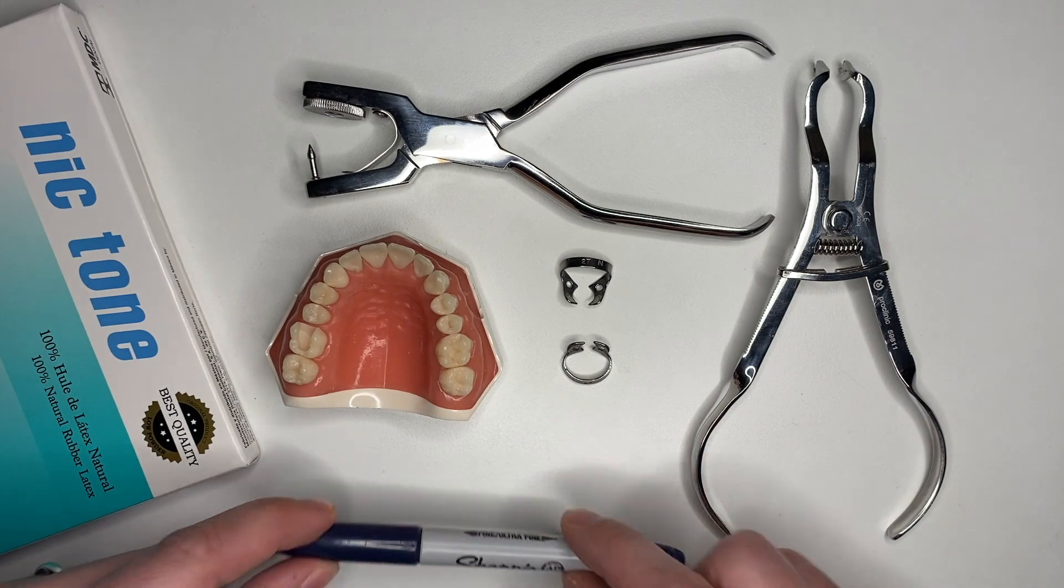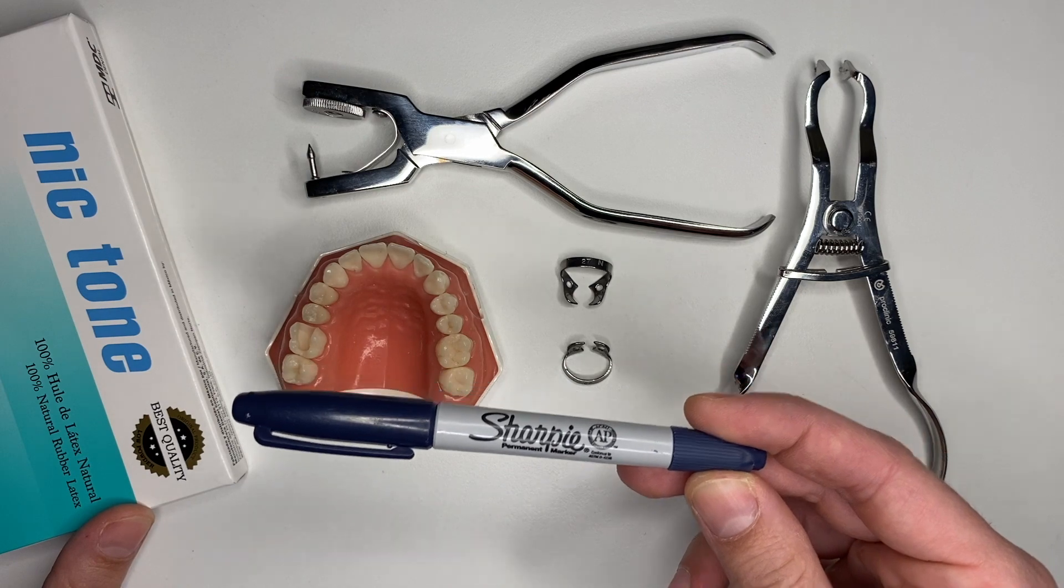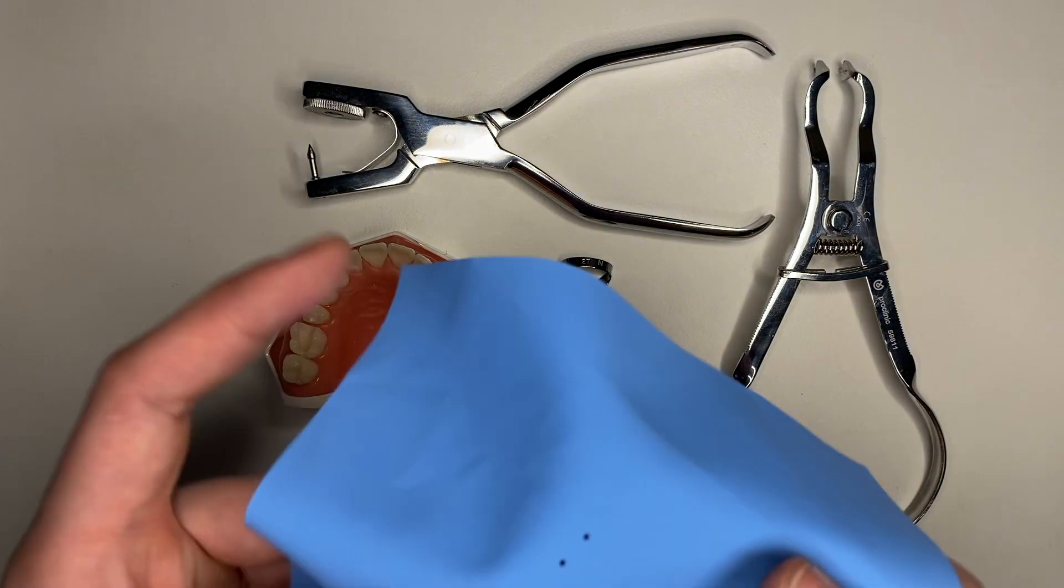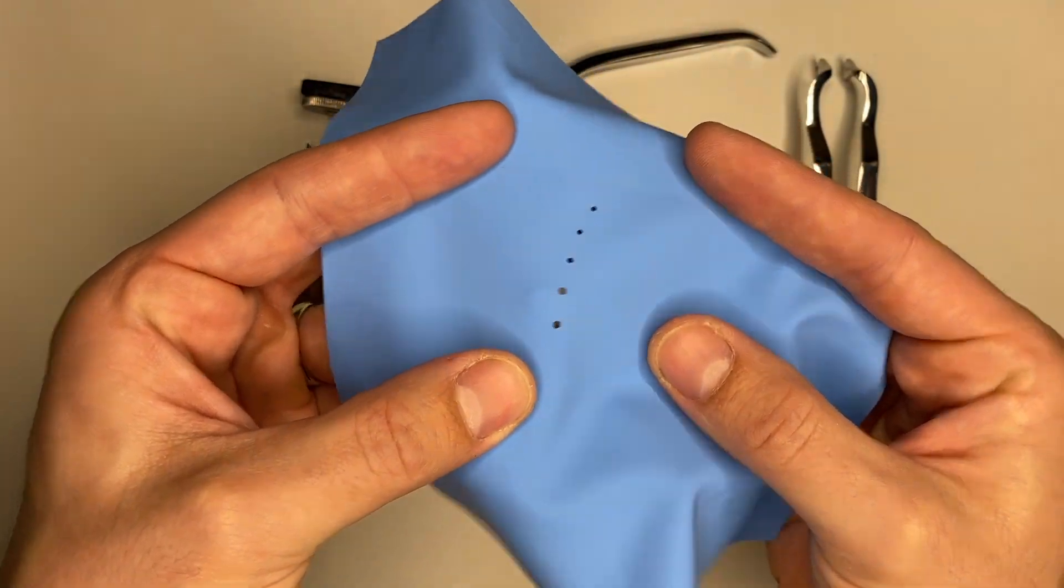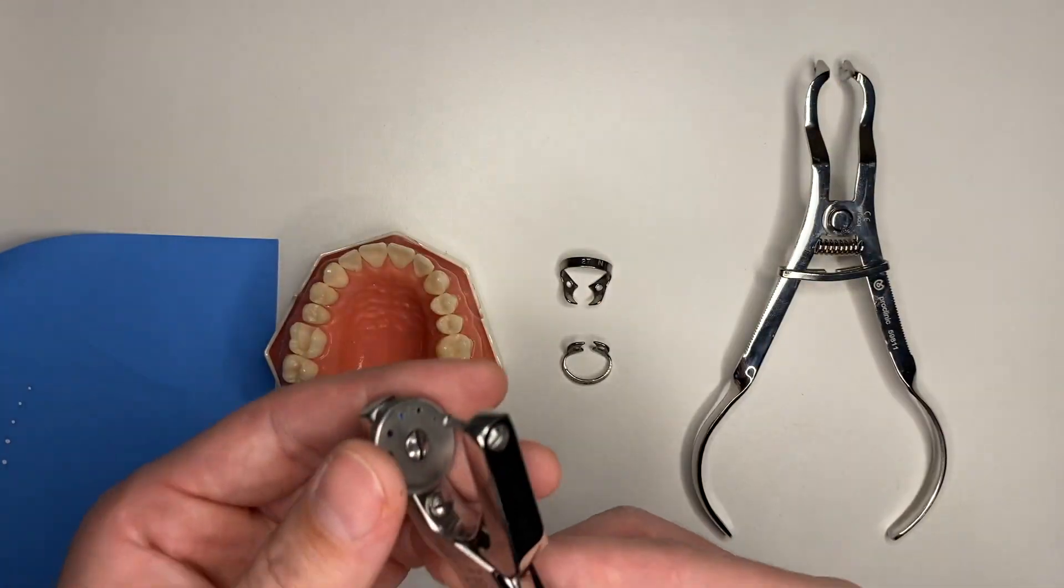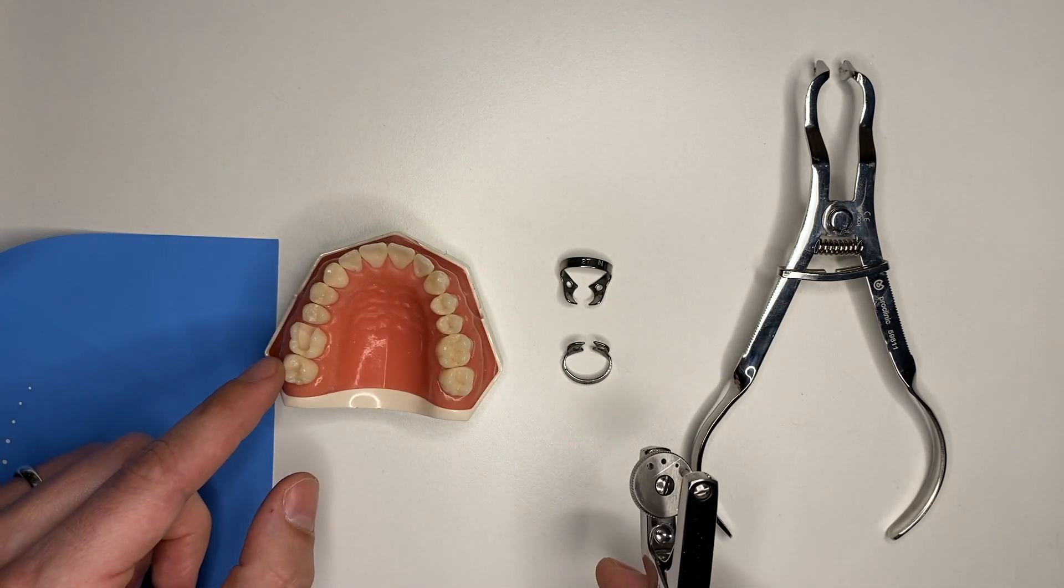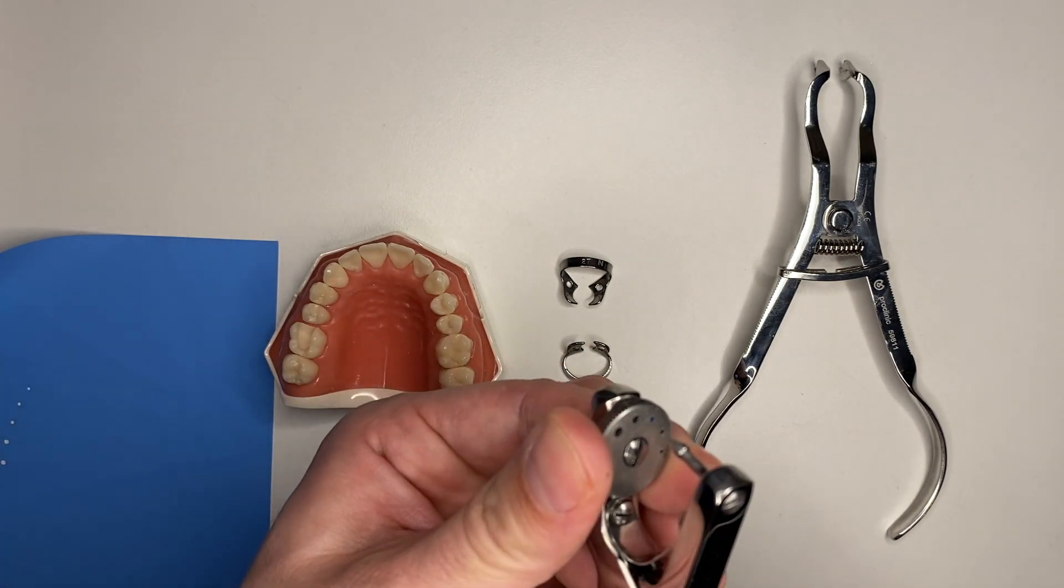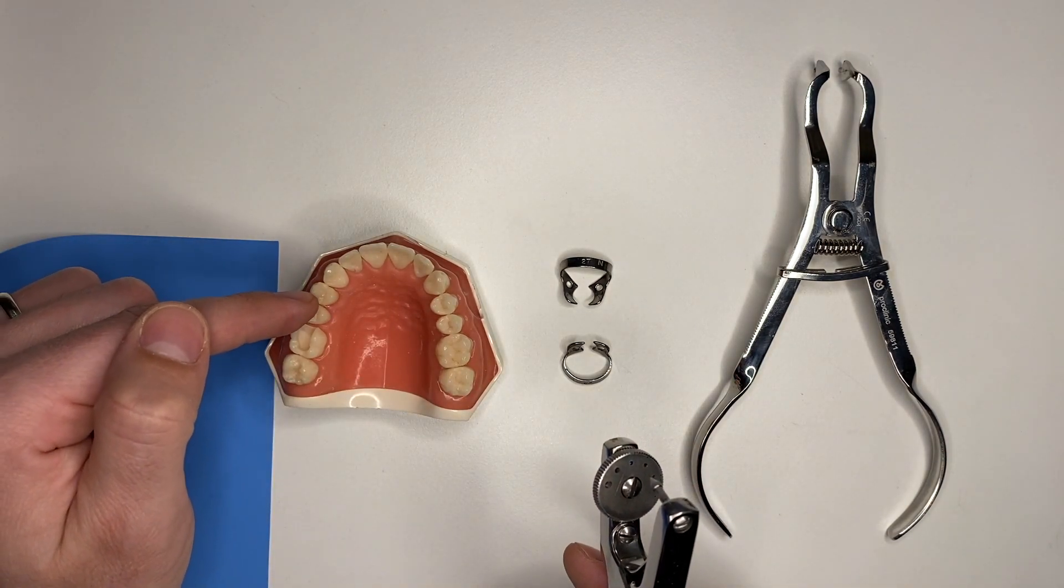That being said, of course it's going to be a Nic Tone rubber dam. I have one that's already been marked and perforated. I perforated it by using the second largest punch hole, this one, for the second molar, the same hole for the first molar, and then I went to the third hole in order to obtain holes for the two premolars and my canine.